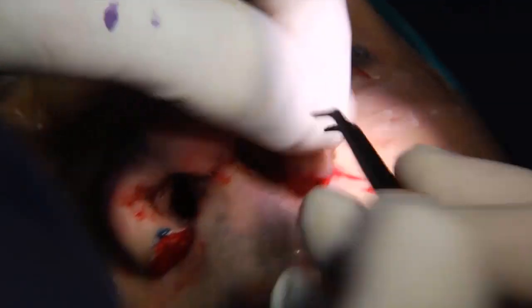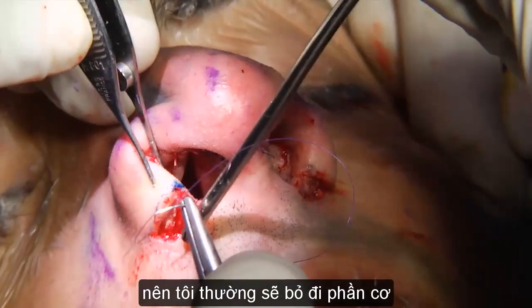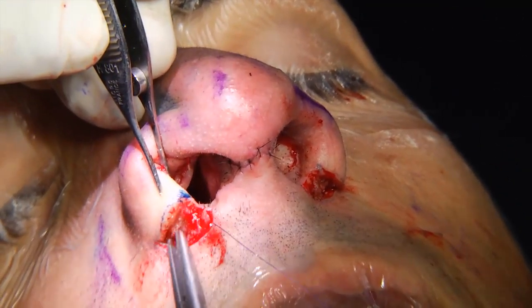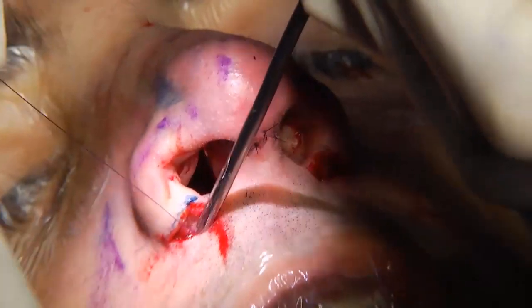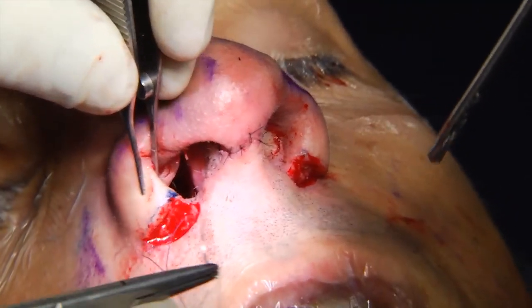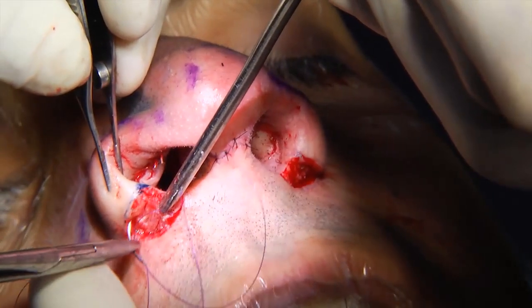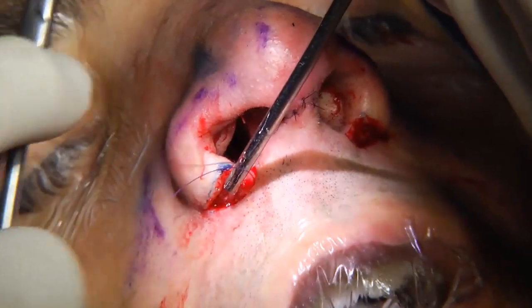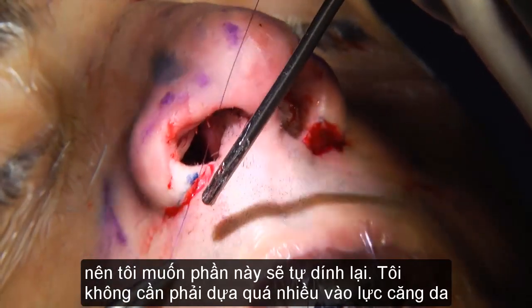So I usually spare the muscle, PDS. So I want this thing to touch itself.